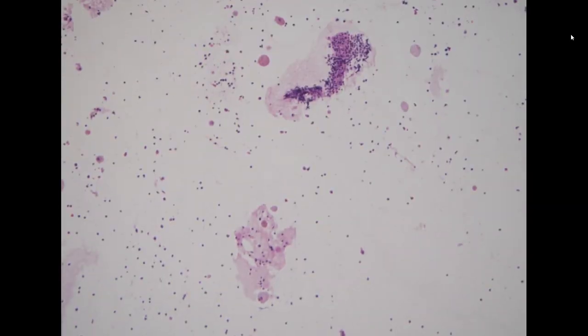I make a note in the report that it is compatible with cyst content and the lymphoid stroma of Warthin tumor, but because we don't have the epithelial cells, they need clinical correlation. I don't think it's good for the patient to keep repeating biopsy for an apparently benign lesion, right?